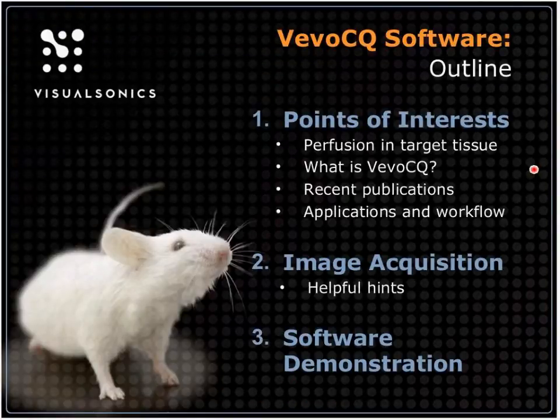I'll give you an outline of what we're planning on heading through in this presentation. As Andrew said, we'll do a presentation. We'll take a little pause for any questions that may have come up during that short presentation, and then we'll move into a demonstration of the actual software itself and some of the capabilities.